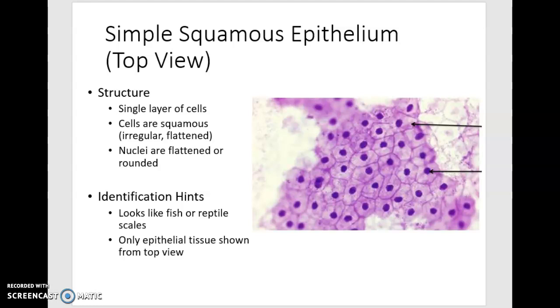Also, please do not memorize the types of tissue based on the color of the tissues, because every lab uses different stains, and we don't want to think, oh, this is a purple tissue, because we could use a blue or a pink stain.